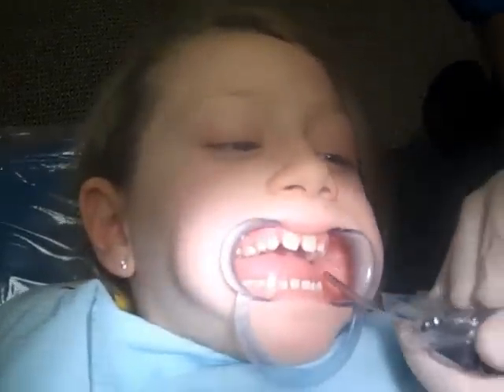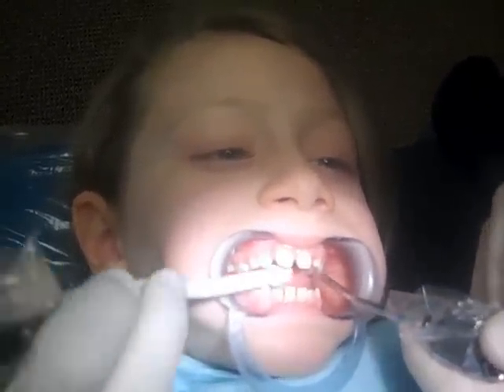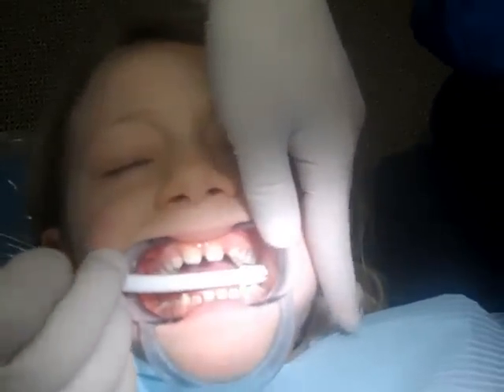Logan is cooperating beautifully with us. We're getting ready to put this in. You've got to keep open so we don't have to do it over again. This is our expander — it's got its glue on and we're ready to go in.